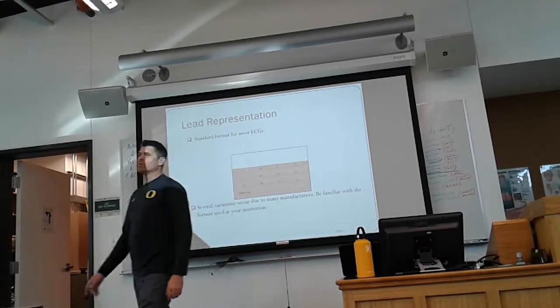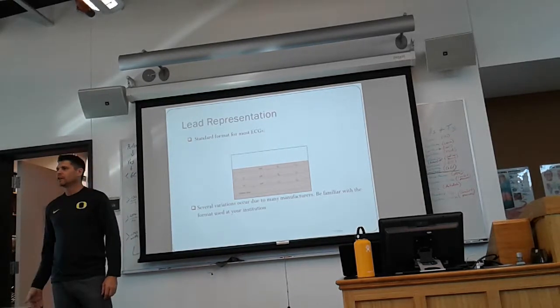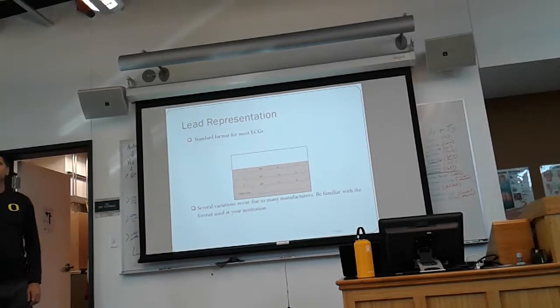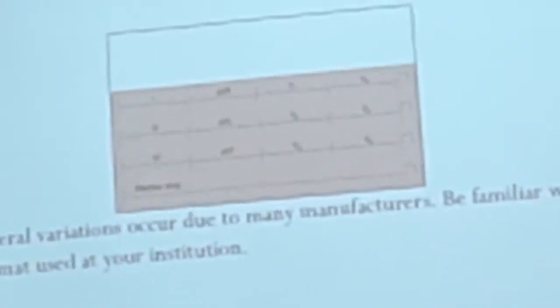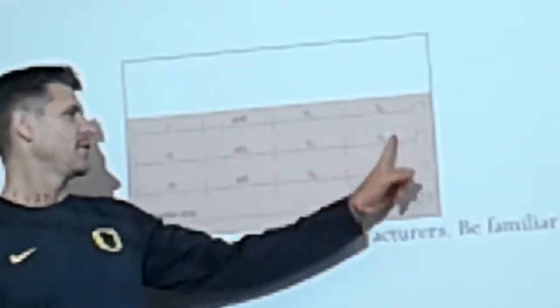On a standard 12 lead, I say standard because it's possible for this to be changed a little bit. We can either force it to be changed, or we can have units that will automatically come out different based on the unit that it is. But under most monitors and most EKGs, this will be the standard way that a 12 lead will be written. So an EKG will come out in this manner, where we have leads 1, 2, and 3 on one column. We have AVR, AVL, AVF on the second column, V1, V2, V3 on the third column, V4, V5, V6 on the fourth column. And it just comes out that way in most circumstances.